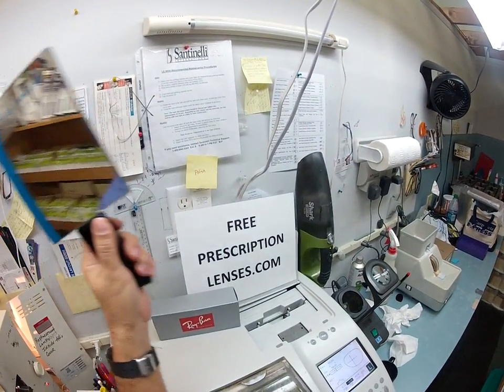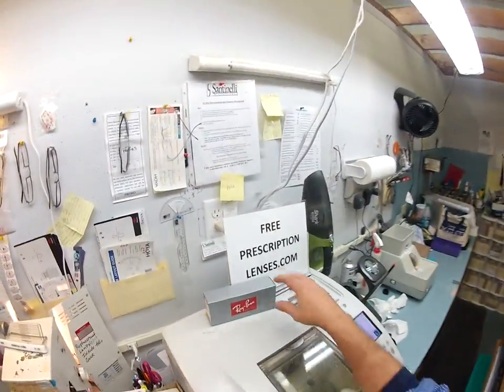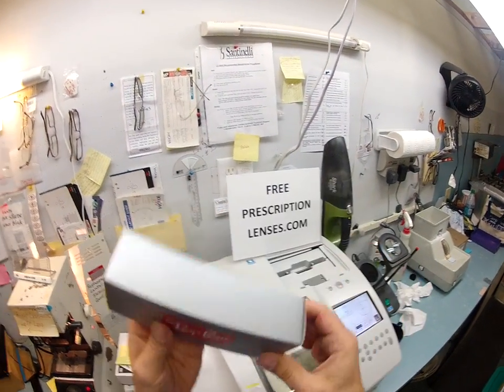Matthew here with FreePrescriptionLenses.com and with the help of my GoPro camera, I'm going to show you how I cut reading glasses for your Ray-Ban. This is the Ray-Ban 2132 New Wayfarer, color 902, Dark Tortoise, size 52.